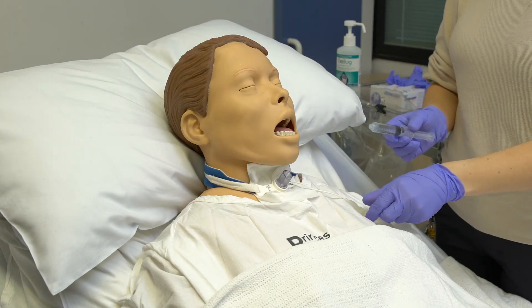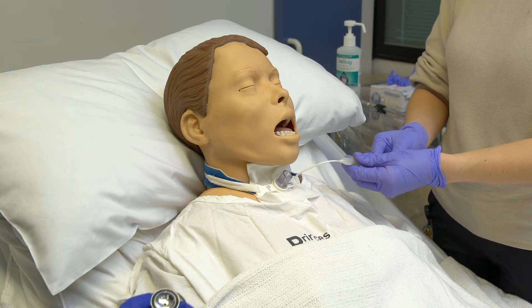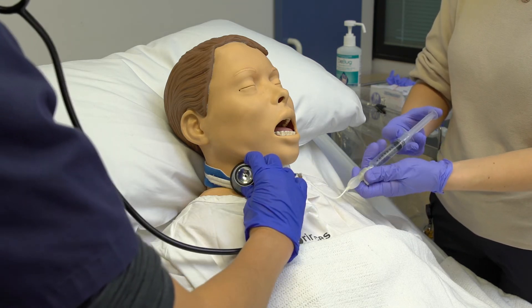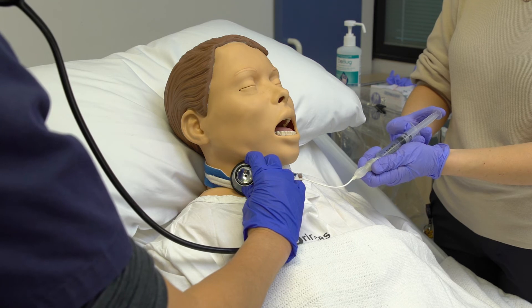Minimal occlusive volume technique for non-ventilated patients: inflate the cuff until there is no audible air flow through the upper airway. Use a stethoscope, or inflate until there are no audible sounds.